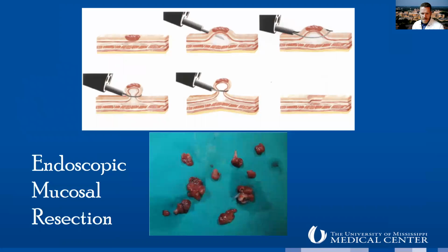So different ways of approaching endoscopic resection. EMR, or endoscopic mucosal resection, most folks in the gastroenterology community are going to be familiar with, surgeons maybe less so. In essence, we're going to do some kind of a lift, some kind of a band or snare to resect these. It's commonly going to lead to a piecemeal removal, depending on how big a lesion you're talking about. I think of it as an excellent biopsy, but not necessarily something that we would consider a curative resection often.